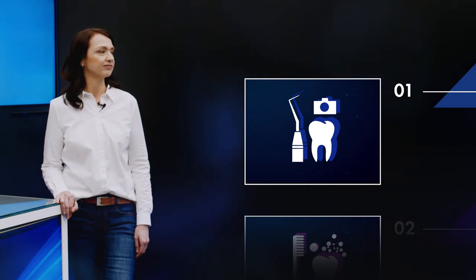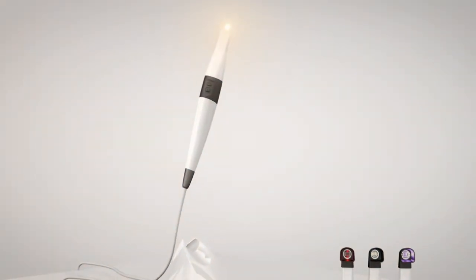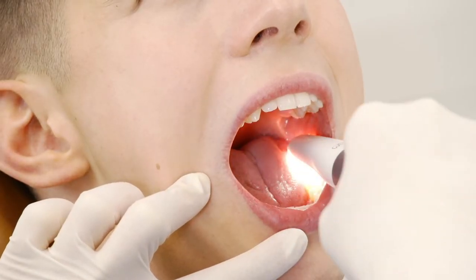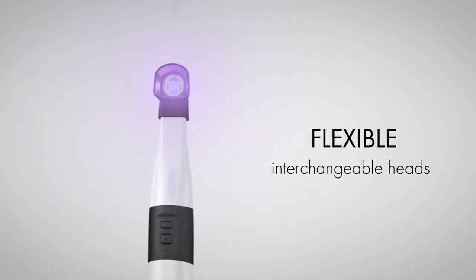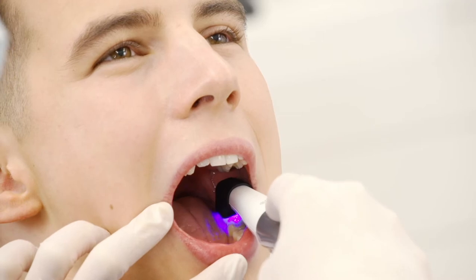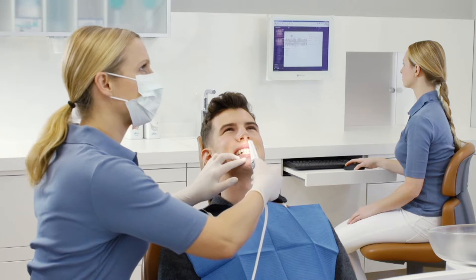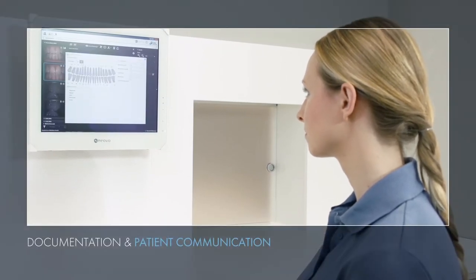We provide the perfect accessories to assist in every stage of the prophylactic treatment session. The first step in the prevention process is all about diagnostics and consultation. The Vistacam iX-HD smart intraoral camera provides a reliable diagnostic tool that can be used both before and after treatment. The interchangeable head technology is highly flexible and provides reliable support during the process of diagnosing caries. It uses methods such as fluorescence technology to create a fast, clear depiction of plaque. Its autofocus technology makes it easy to take oral images that can be used for documentation and are also a useful aid in communicating information to the patient.